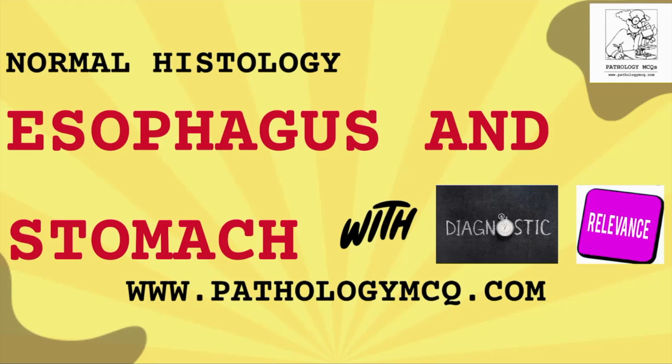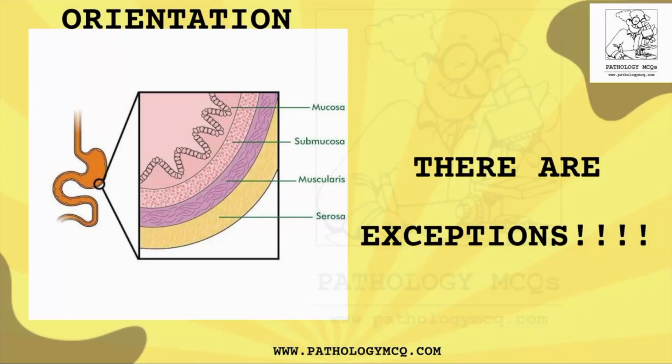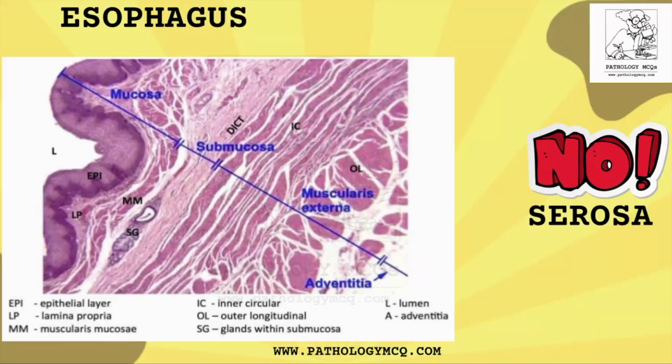Let us discuss the normal histology of esophagus and stomach with diagnostic as well as clinical relevance. The gastrointestinal tract is a hollow tube-like structure which has a central lumen, mucosa, submucosa, muscularis, and serosa. This is true for most parts of the gastrointestinal tract. However, there are a few exceptions. For example, in the esophagus, there is no serosa. Instead, there is an adventitia. The serosa is a visceral peritoneal covering. However, the adventitia is just a connective tissue which supports the esophagus.